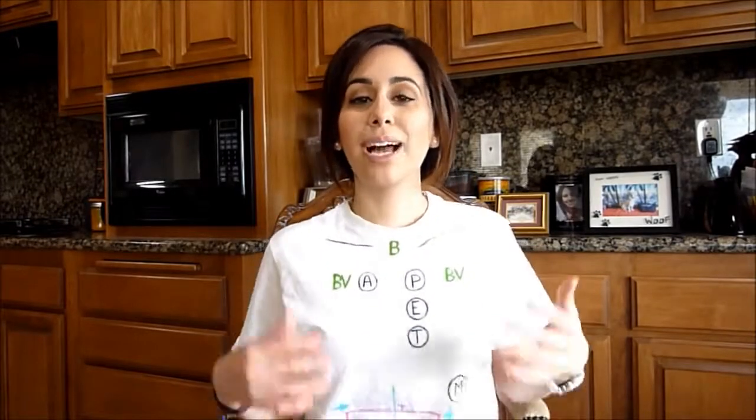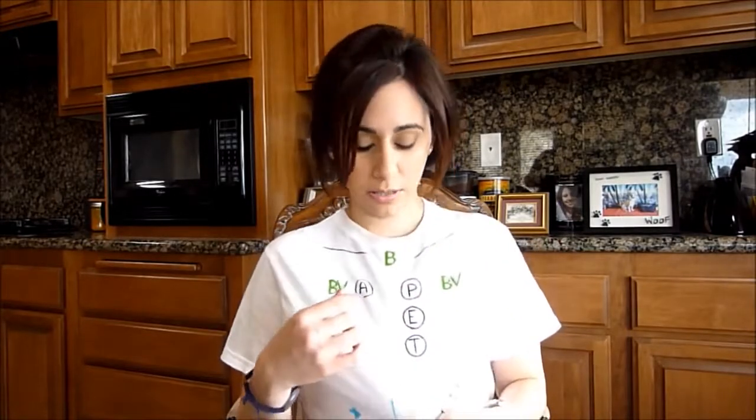So how are we gonna find this? Because obviously I marked this all over my t-shirt, which is the black ones, these ones that are in circles. And an easy way that I found my landmarks is to find your clavicles first, and I drew those lines up here. I hope they are matched up with my clavicles. But an easy way to do that is to push out your clavicles like this. I hope you can see it, because I can feel it. And you're going to take your first finger right under there, and that is your first intercostal space.